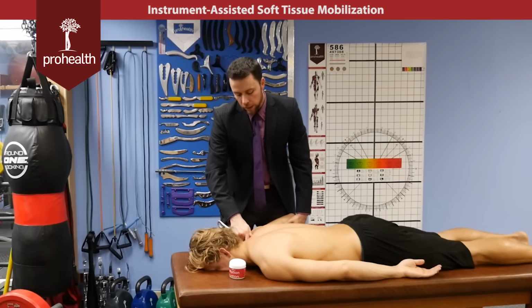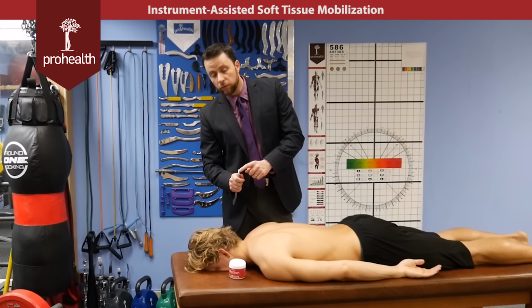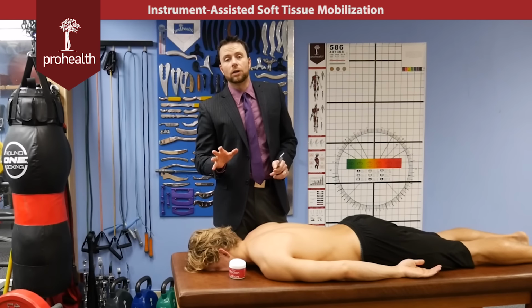Shorten, lengthening action. Taking the contact pressure off of your thumb and onto a very specific edge gives you specific treatment. When most patients say they want deep treatment, what they actually mean is they want specific treatment. Tissue-specific treatment results in better outcomes.